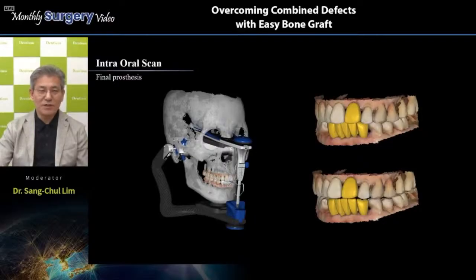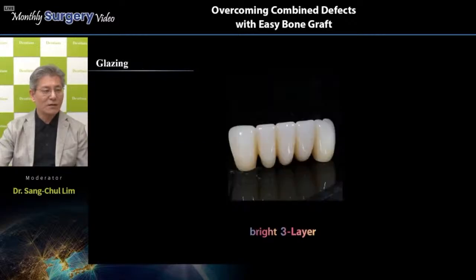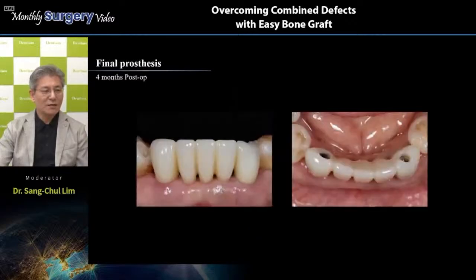Actually, all of these procedures were done on the CAD program and Dentium 3D viewer. And contouring and glazing, and the final process is here. Four months after surgery, finally this final zirconia 5-unit bridge, supported by Bright TL implants, was inserted into our patient's mouth.